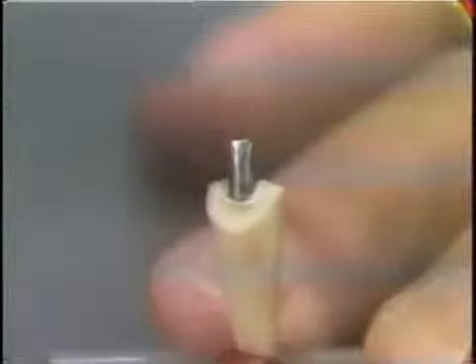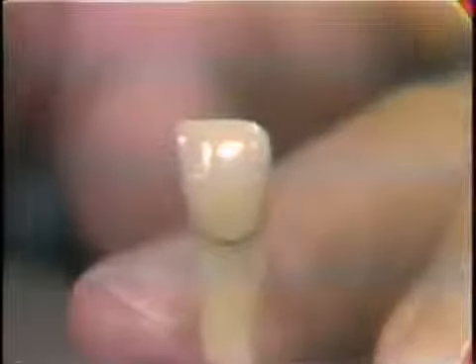High interproximally, it drops down on the lingual surface, rises again to the other interproximal, and drops down on the labial, and the preparation is carried, of course, beneath the gingival margin there, so that the little margin of gold there will be hidden from view. I'm going to take off this gold part of the crown now and place the finished crown on with the acrylic facing in there. And there you see the preparation with the acrylic resin facing.